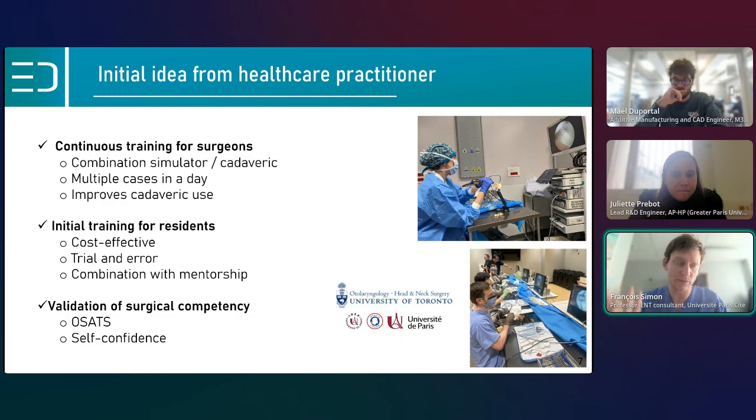And so they do different diseases. They train. That means they know where to do the incision. They learn the different steps. And then the next day, we use the cadaveric subject, which still, of course, has a more lifelike perspective, which is normal anatomy. But then they take greater benefit of the cadaveric use also, because they've had the training on the previous day on the simulator. They know exactly what they need to do. They've already gained considerable experience and confidence on that first day, and then they take all they can out of the cadaveric subject there.